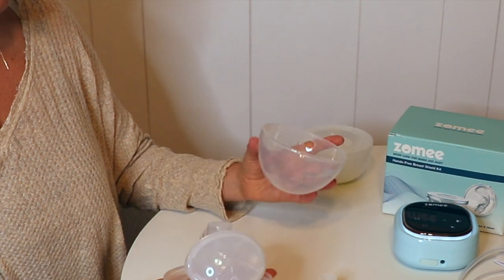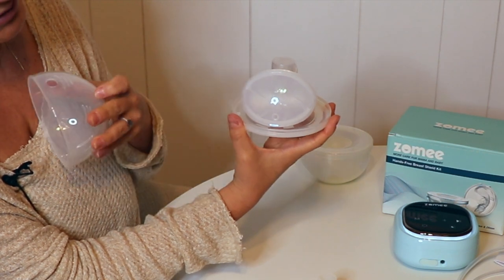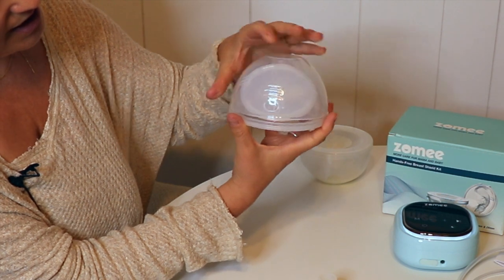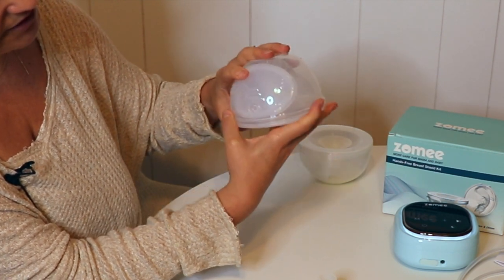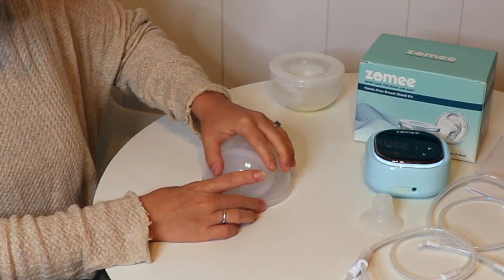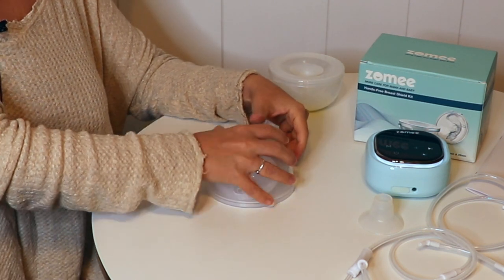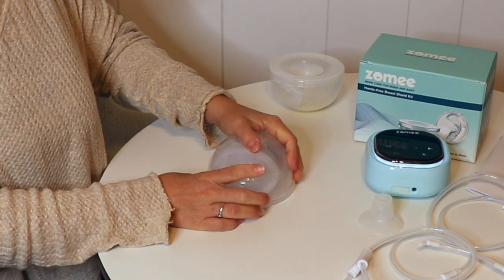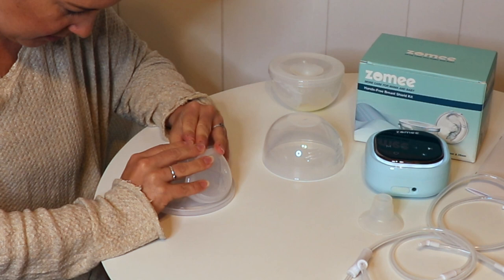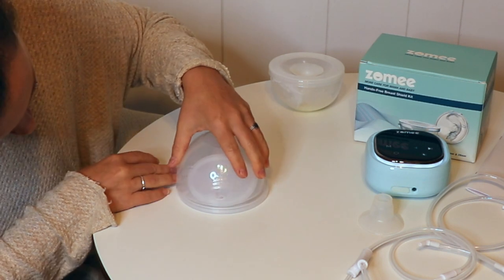Then put the flange back in the hole — there are little slits in the flange and you're going to line them up. There are little parts where you have to line that up so that it fits; there's only one way that it will go. When you put the collection cup back on, the pouring hole needs to line up perfectly with the hole for the tubing. This part is a little bit tricky at first — I've had a hard time getting this to snap into place, but I found that if you put it on a hard surface and push down it works best. You really need to get everything lined up perfectly before you snap that cover on.